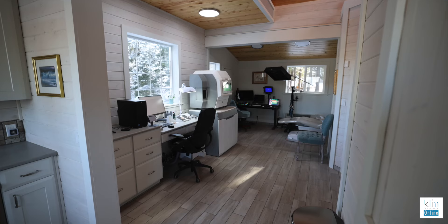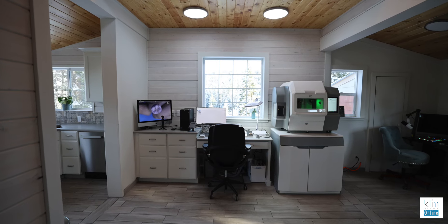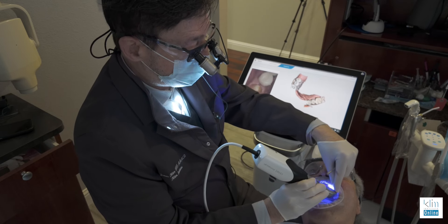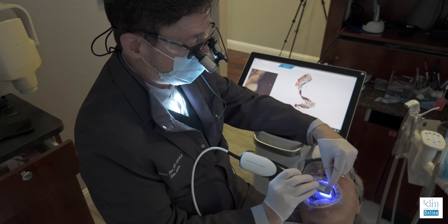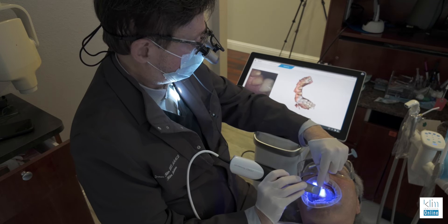I have found very good success with all the zirconia options in our surgical clinical theater, even though I'm using other methods here up at my homestead. I have a digital lab and I'm using the PM7 and some other approaches within digital dentistry. I'm still a solid PrimeScan and PrimeMill M6L user — it's been very useful for me in my clinical theater. I'm very grateful for that technology. I did want to address my method that I've used with a lot of success keeping zirconia crowns and bridges in place. If you have any questions or comments, make sure you post them below.